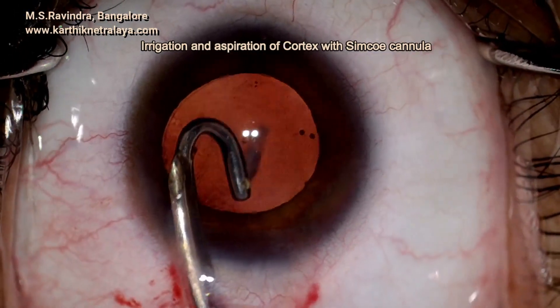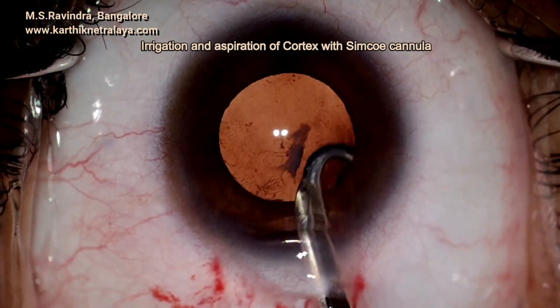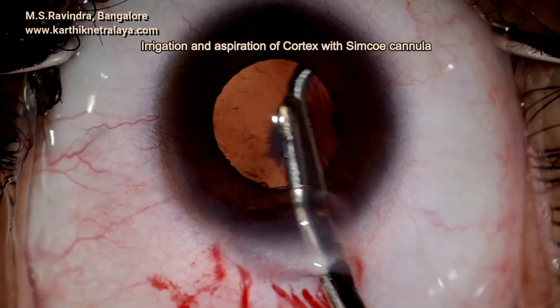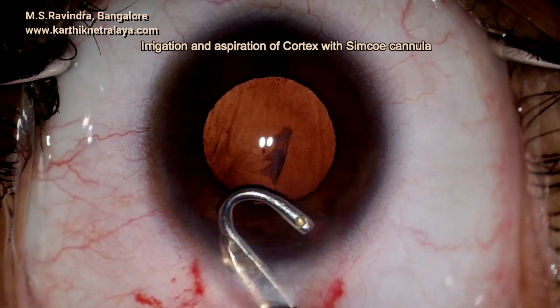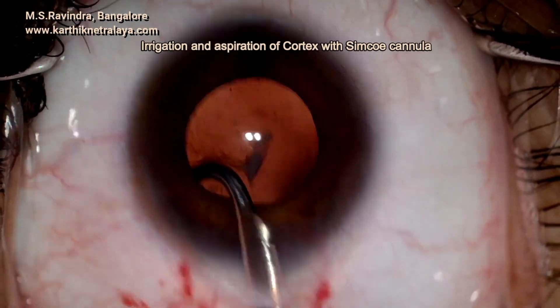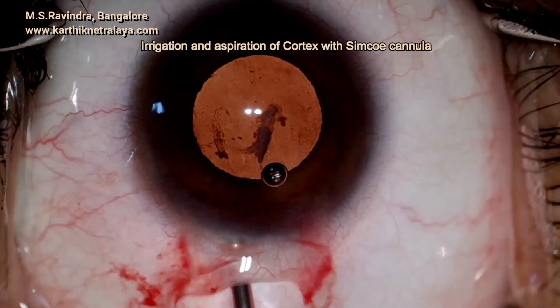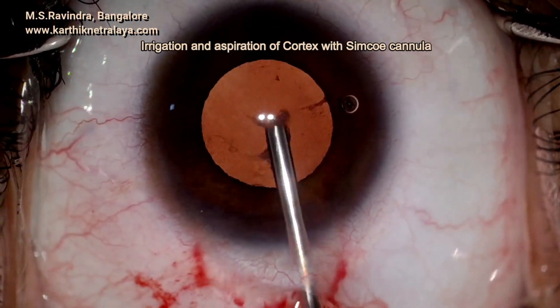This technique does not need a machine. All the steps of the surgery are done by manual methods. Preoperatively it was assessed that the capsular bag is of normal size, commensurate with a normal-sized eyeball, in spite of the cornea being smaller.